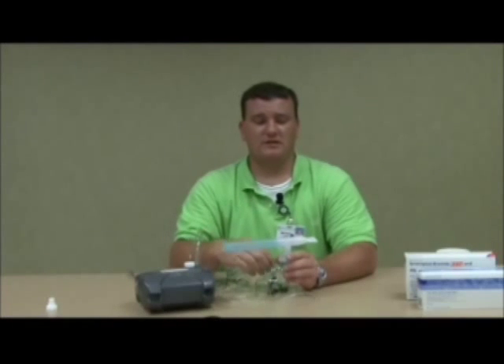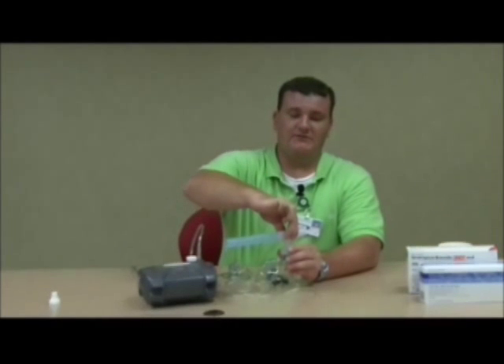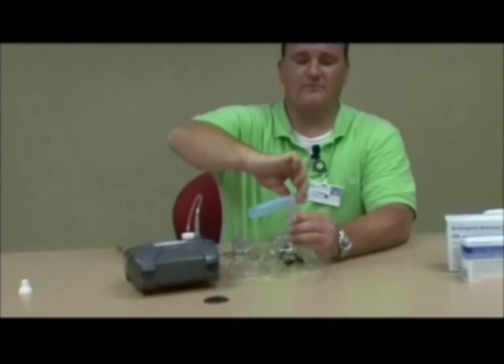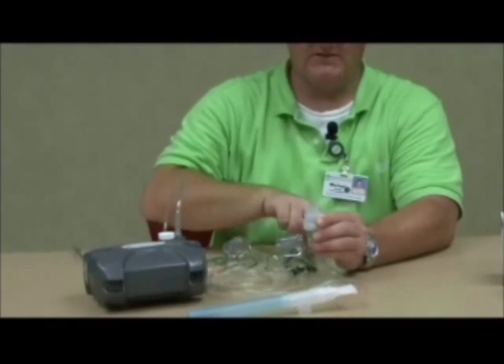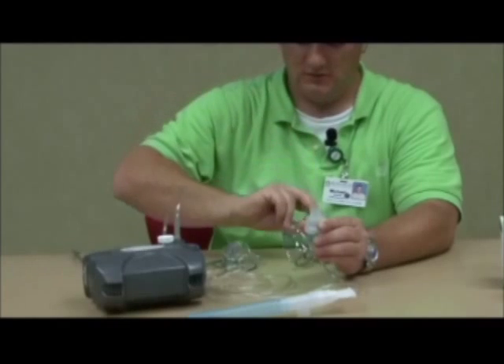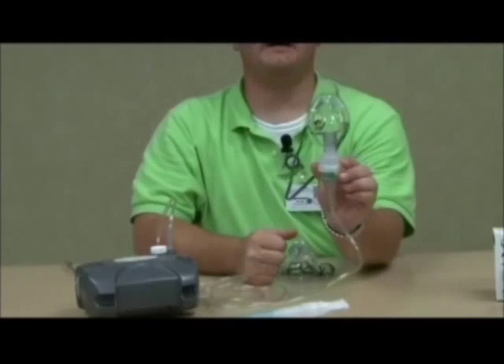If you are using a nebulizer and would like to use the face mask, simply take off the T-piece connection from the mouthpiece and attach either the adult or pediatric mask, depending on who is using it, to the top piece, just like that.